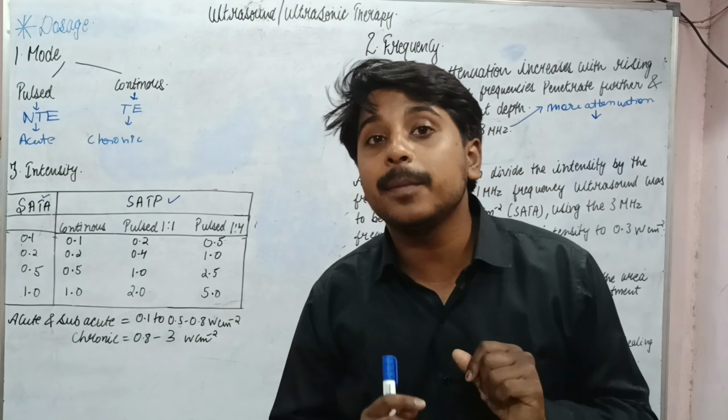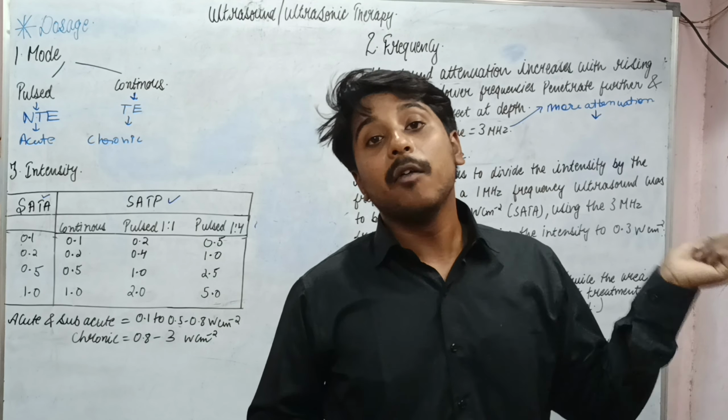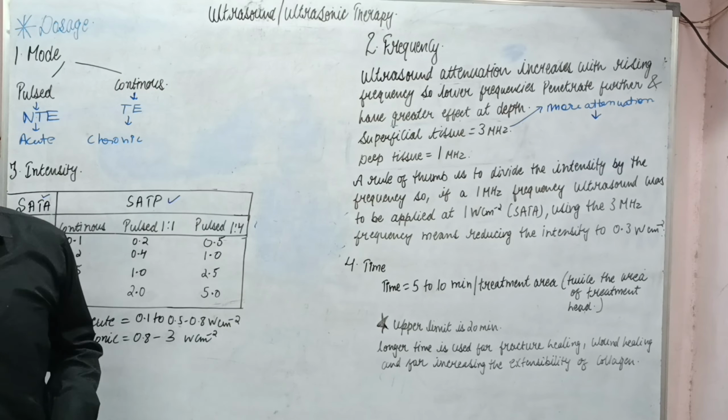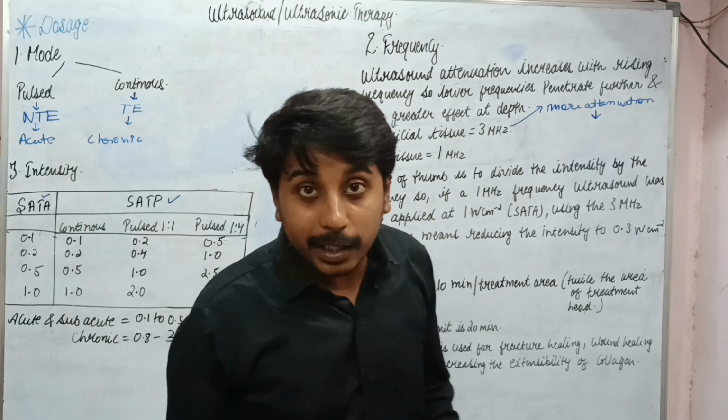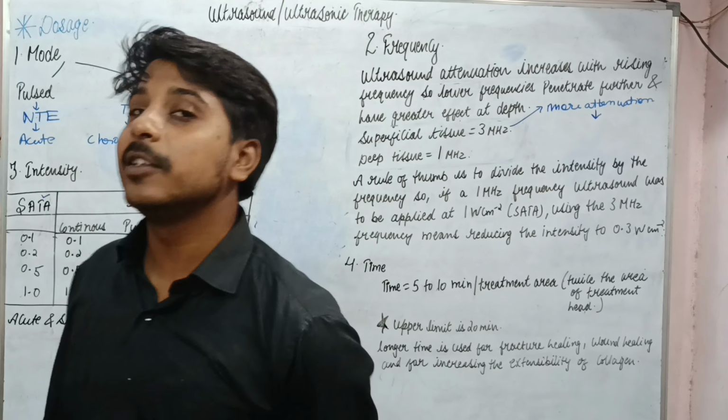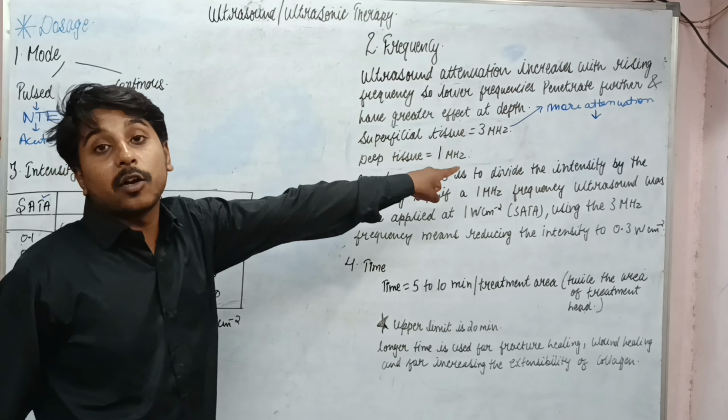और इन तीनों में से भी जो चीज डोमिनेट कर रही है वो क्या है? It is absorption which is dominating. And क्या absorption हीटिंग करेगा टिश्यू की? डेफिनेटली करेगा. और क्या हीटिंग से बर्न होगा? This you know very well. Yes, it can cause burn.